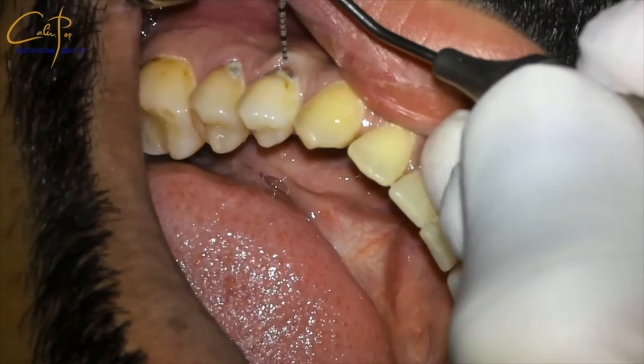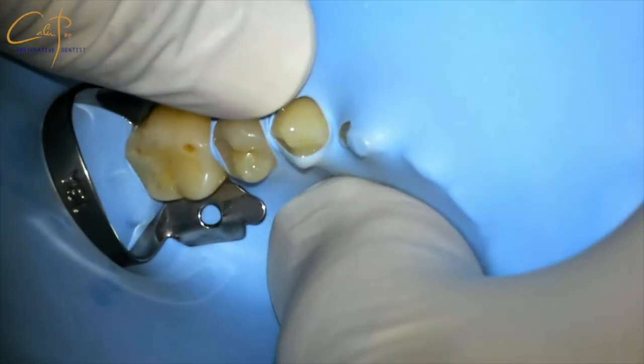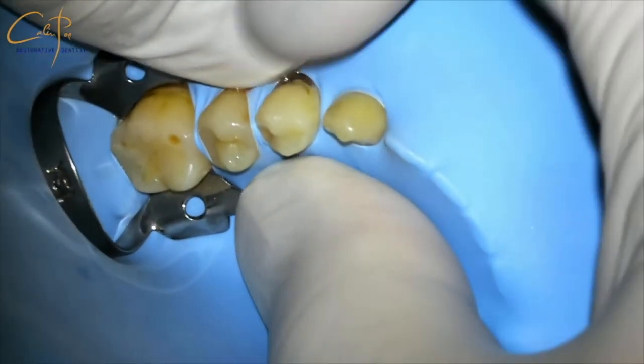First of all, I am using a periodontal probe to evaluate the depth of the sulcus. The index finger of the left hand is supporting the clamp to have more control and to safely place the clamp without traumatizing the gum. I distribute each hole to each tooth to be exposed and ask my assistant to take over.